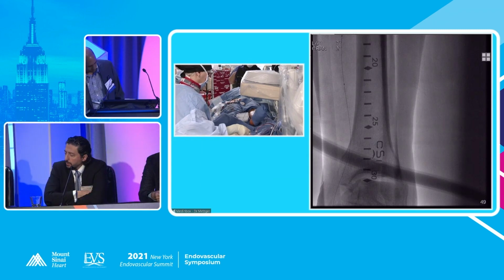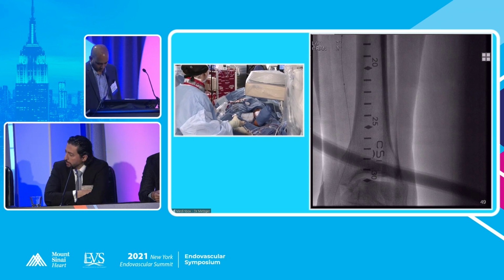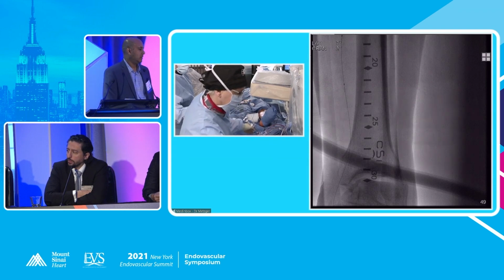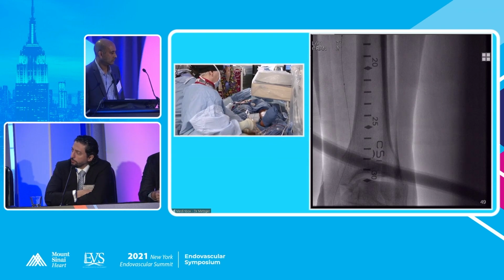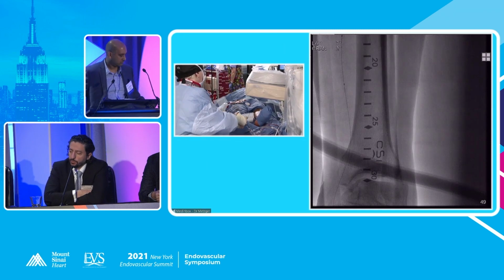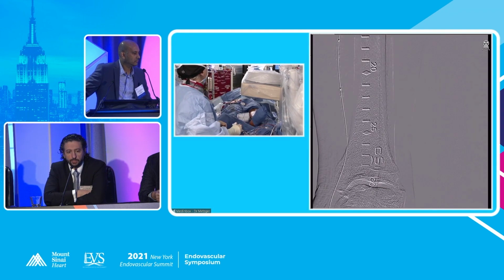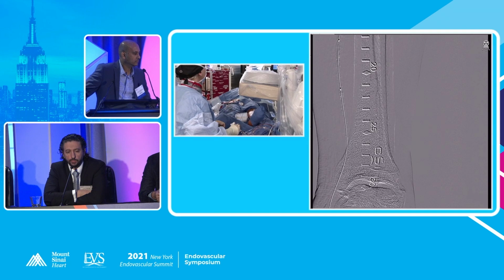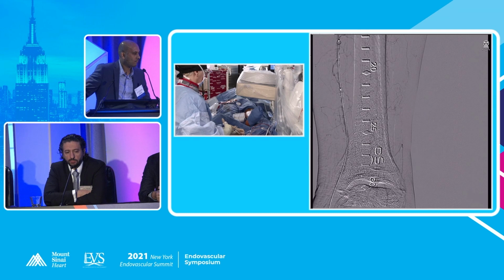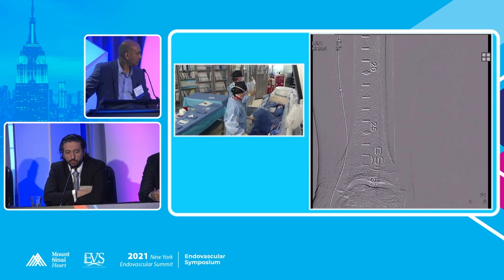I don't know. I might be in the minority here, but if this was in my lab, I agree with the previous comments. If there's a reason not to do the common femoral artery surgically, then we would consider an endovascular approach. But I would definitely pursue the tibial flow. I mean, all the data, just what Dr. Razavi just spoke about, you need inline blood flow to these wounds. So this patient will need something even after you treat the common femoral artery. It's just a matter of the percentage and the time that you're willing to wait for it.